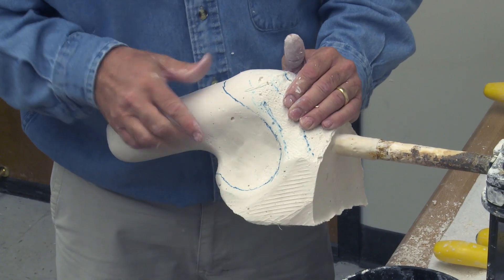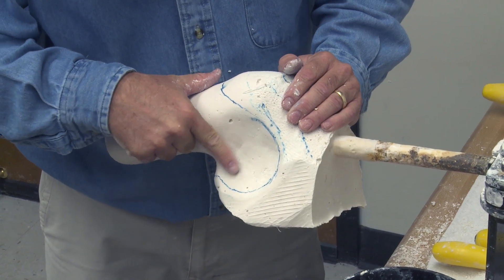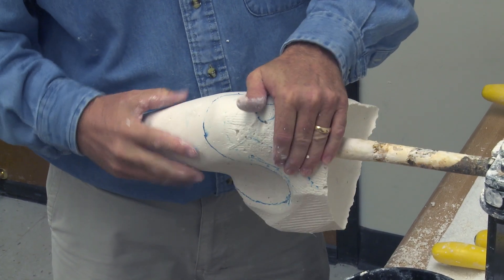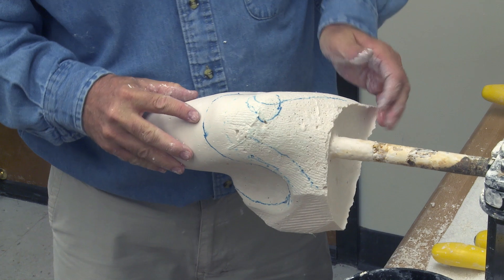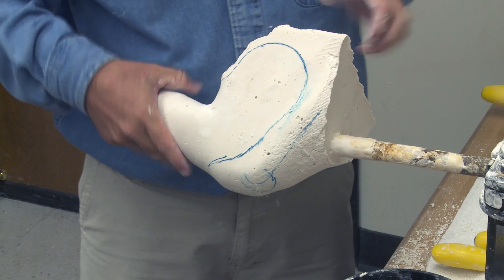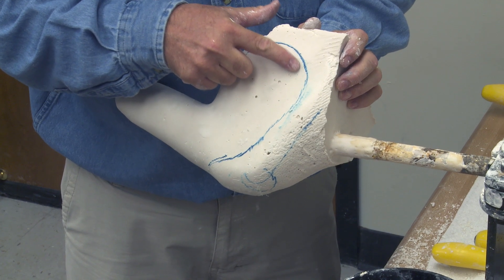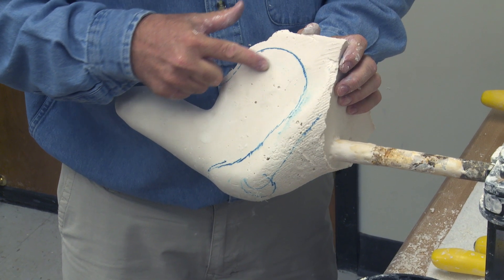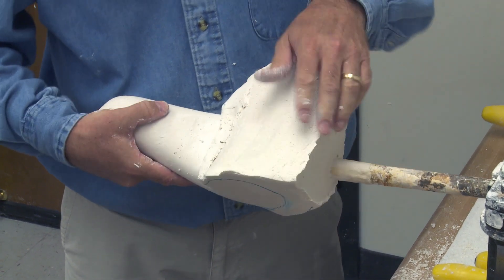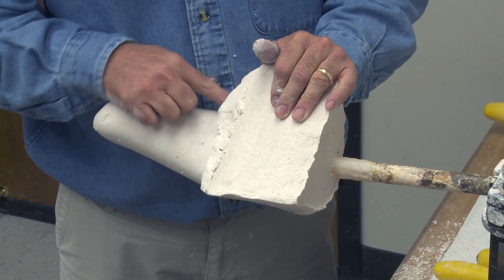Notice the trim line follows around inferior to the clavicle, with the AP tightened over the head of the humerus. Moving laterally, drop to the level of the deltoid. In the final socket, these can get as low as the insertion of the lateral deltoid. Posteriorly, the trim line follows the inferior spine of the scapula and encompasses the entire scapula. The trim line can always be made smaller in the evaluation socket. Finally, the medial wall follows the latissimus dorsi into the axilla and pectoralis tendon back around anterior.